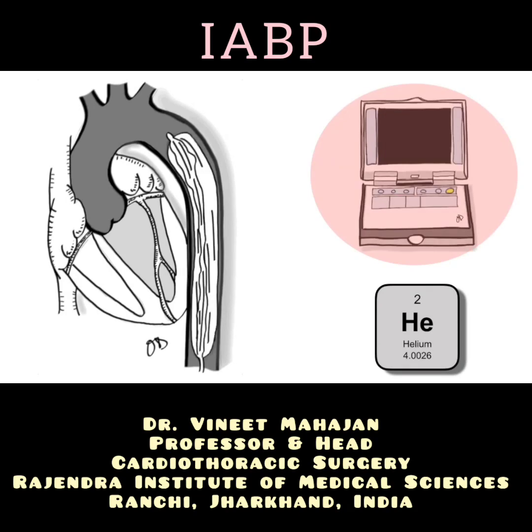It regulates the inflation and deflation of the balloon by shuffling the gas helium in and out of the balloon chamber. Helium is used because of its low molecular weight, allowing rapid inflation and deflation, and its high dissolubility in blood, mitigating the risk of emboli if the balloon ruptures.